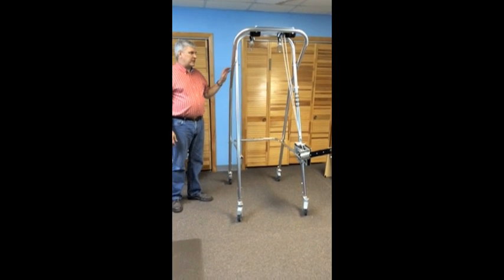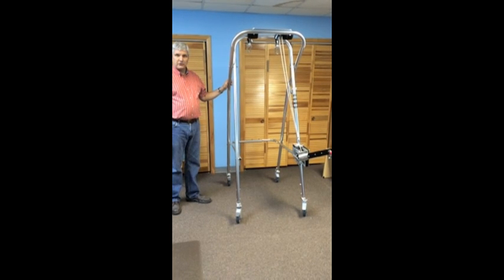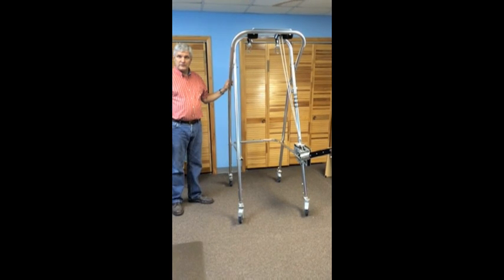I'd like to describe a few of the features of the SW7. This is the larger of Kay Products' partial body weight bearing suspension walkers. This unit will take people up to about 6'2", 250 pounds.